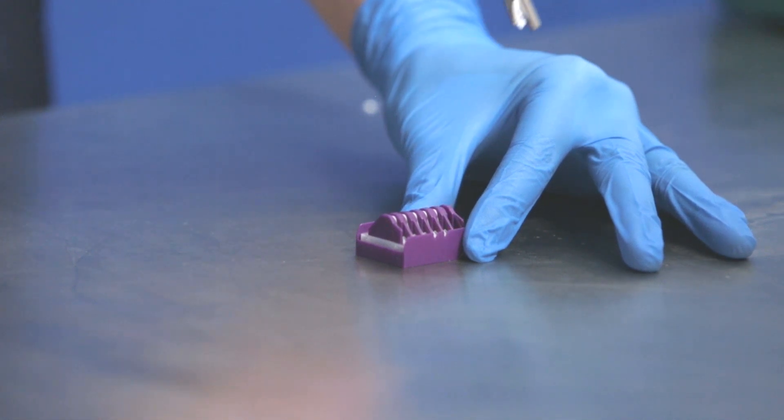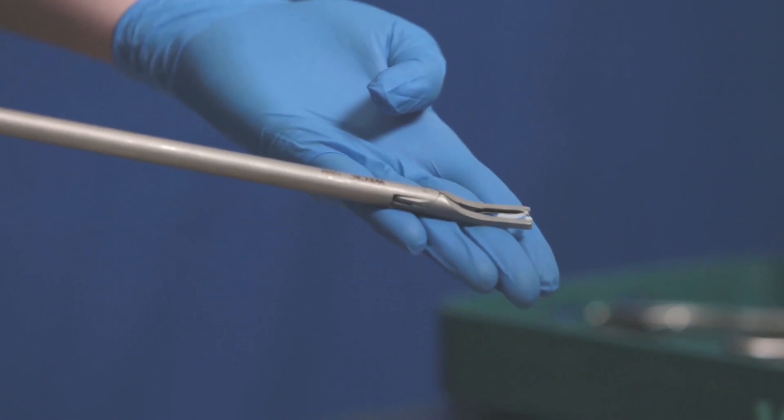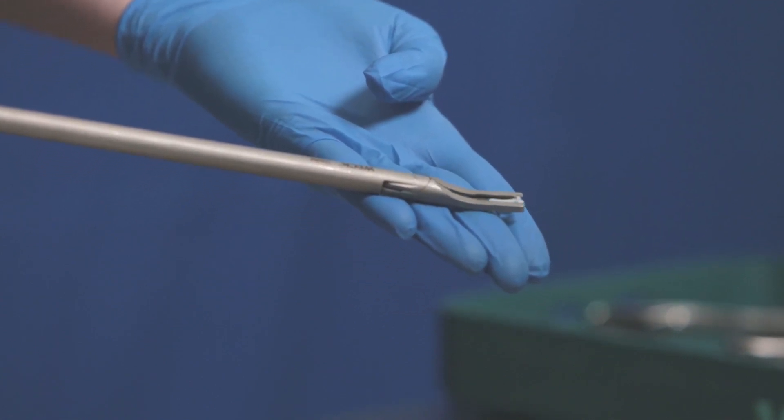With the clip loaded, check to ensure it is securely seated in the applier jaws. The clip bosses should be seated in the notches of the applier jaws.